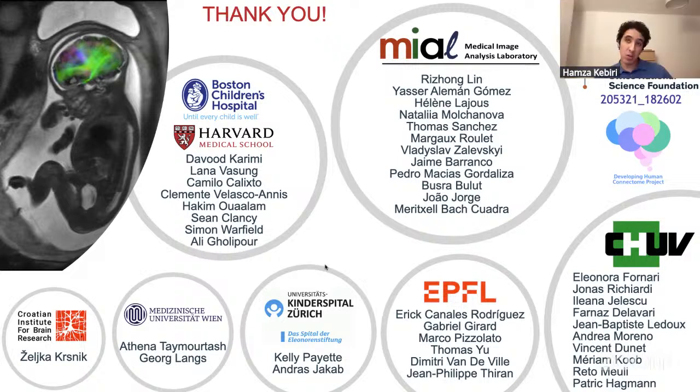And also there is maybe another reason that we exploited here. When you project into this spherical harmonics basis, you make your input independent of the acquisition, in the sense that if you have different acquisitions, let's say with different gradient directions, the spherical harmonics somehow normalizes this. So these are maybe the two reasons.